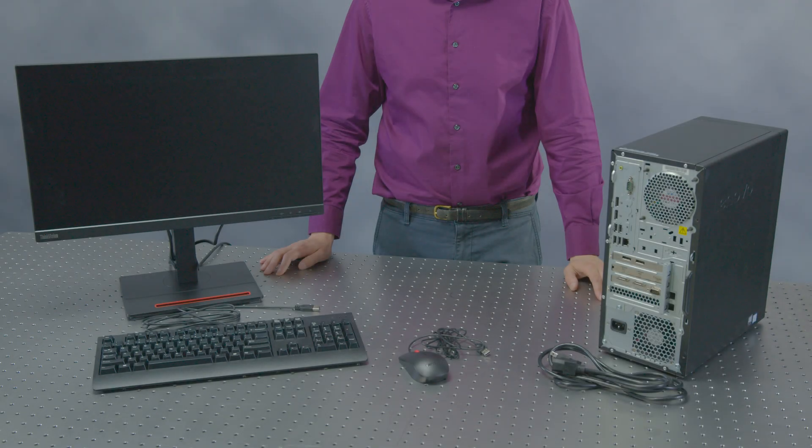Open the box labeled PC system and carefully remove the components. Set up the computer, monitor, mouse, and keyboard. Imaging software comes pre-installed on the PC.